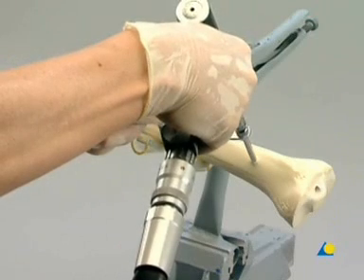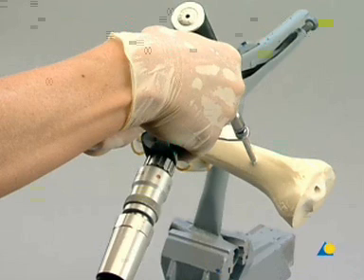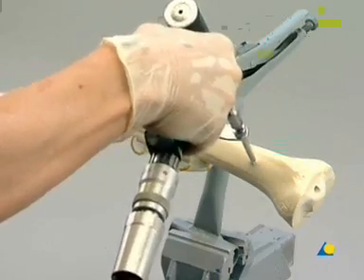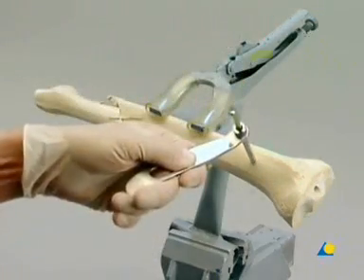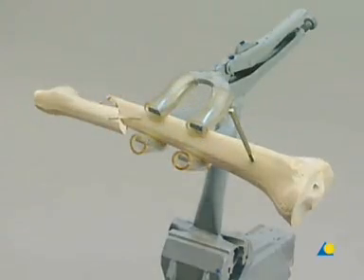The image intensifier can be used to check the final position of the Schanz screws. The tip of the self-drilling Schanz screws must be anchored in the far cortex to ensure stable fixation. Penetration of the far cortex is not necessary. Once the Schanz screw has been placed, it is released from the adapter and the drill sleeve assembly is removed.